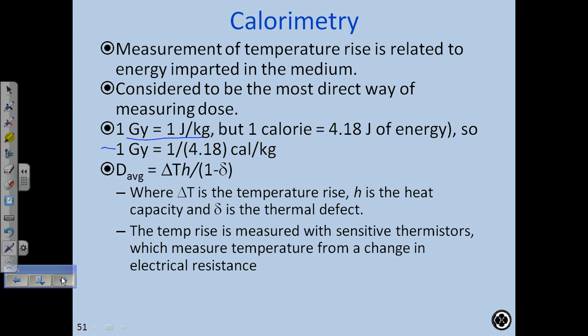So that's calorimetry. Of course, the calorimeters are large. They're big, so you can't put it in a patient. You can't put it in a phantom. They're large. So it's just an accurate way of measuring those directly.